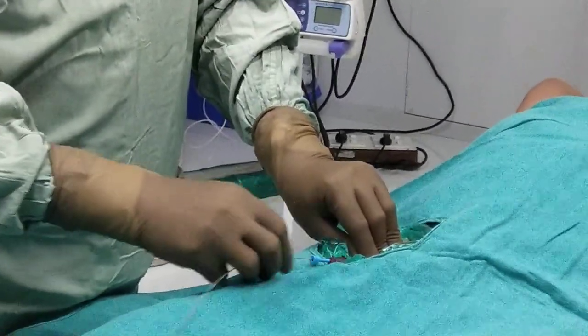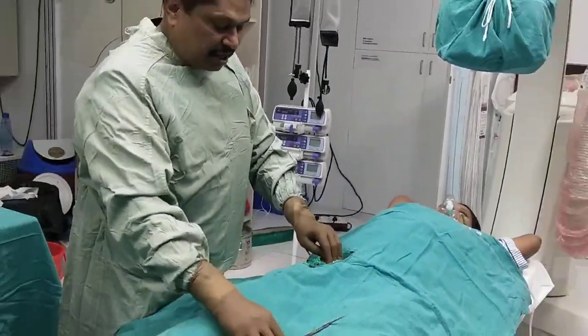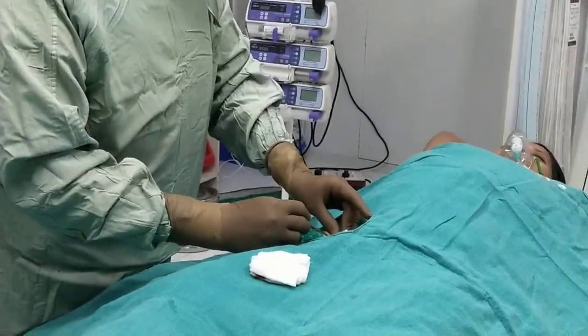For the procedure we are taking both the femoral artery and vein for access. We are putting a femoral artery sheath of 6 French.